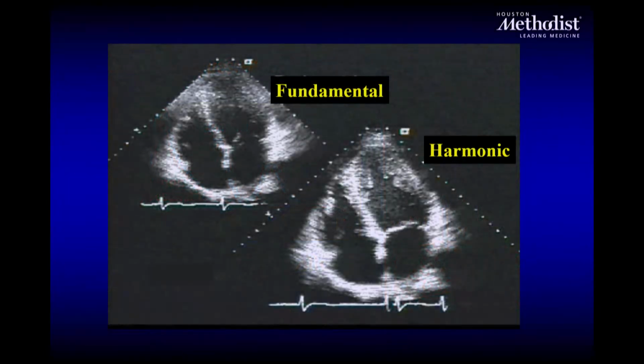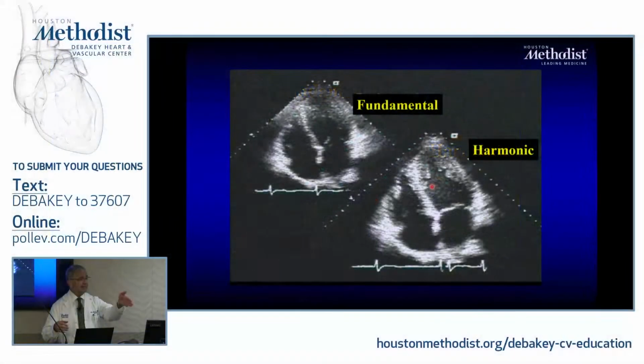There is an advantage of imaging with harmonic: it takes away some of the clutter that I showed you before. Take a look. This is the same image with fundamental, and this is with harmonic. So I'm imaging at 5, let's say, but I'm emitting at 2.5.